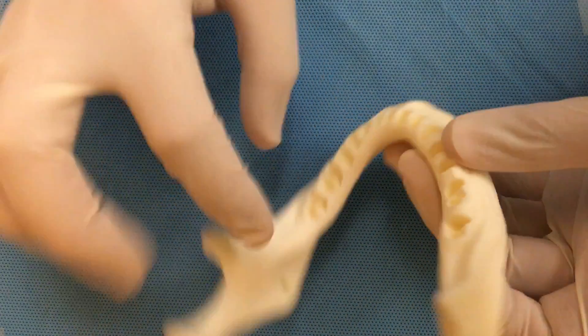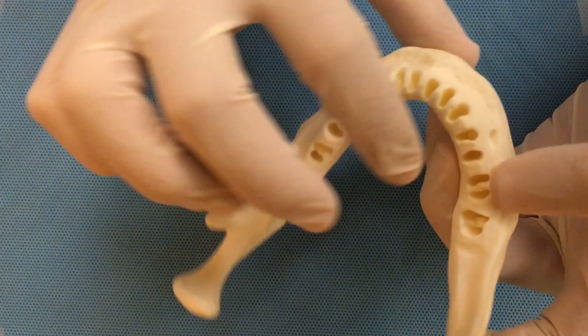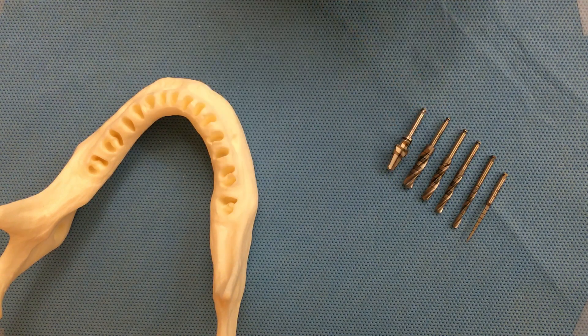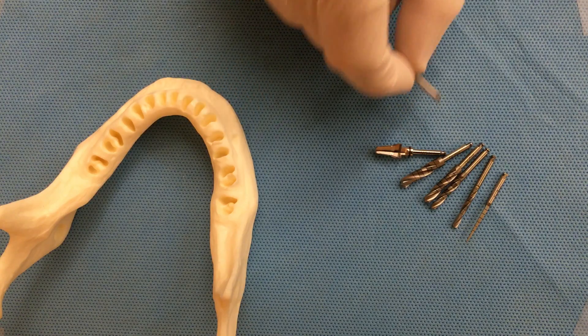Today we're going to do an immediate implant. This is an extraction socket — a recent extraction socket — and we are planning to place an implant. These are the drills we will be using: this is the initial drill, this is the 2.3 drill, 2.8, 3.5, 4.2, and the last one which is called countersink. We may also need a drill extender, so we save those on the side.